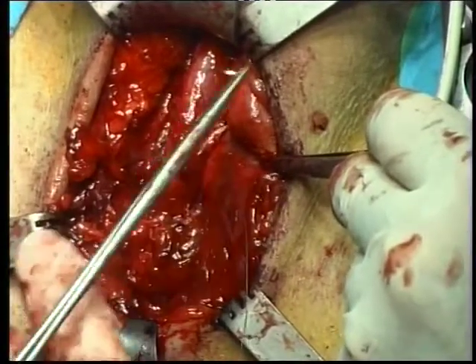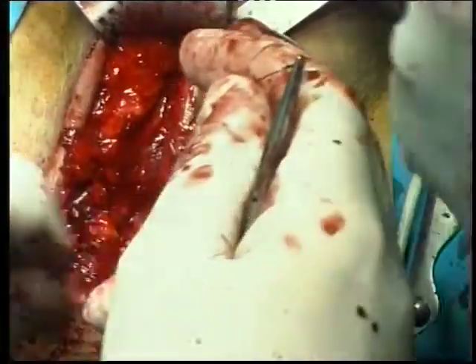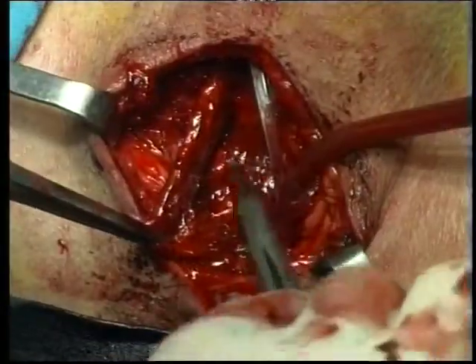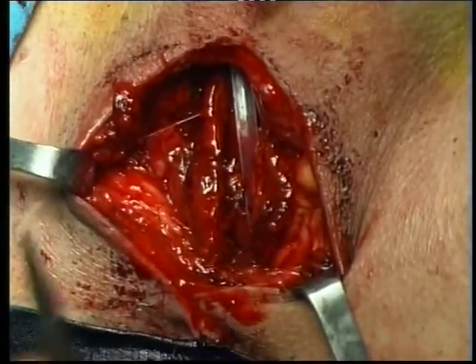Once the anastomosis is finished, we secure the urethra to the corpora cavernosa with 2 to 4 further stitches. After hemostasis is complete, we leave a small periurethral suction drain and close the bulbar spongiosus muscle over the bulbar urethra.